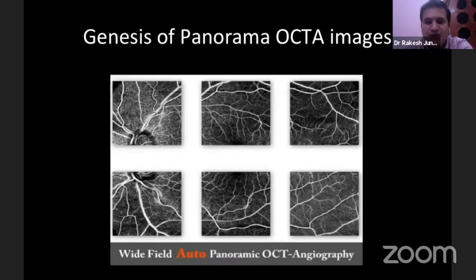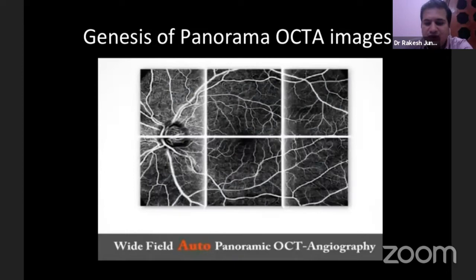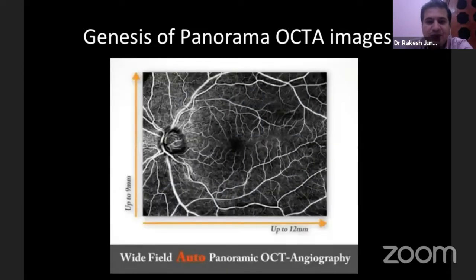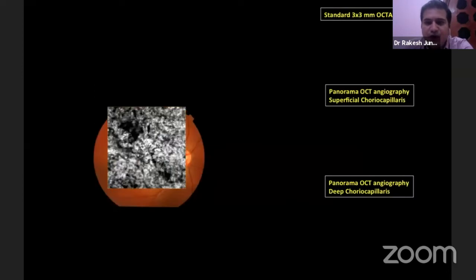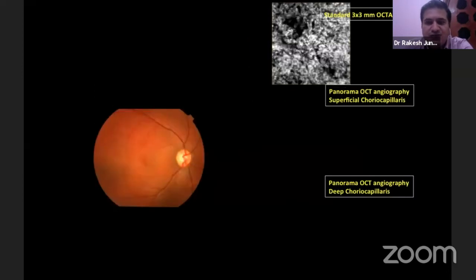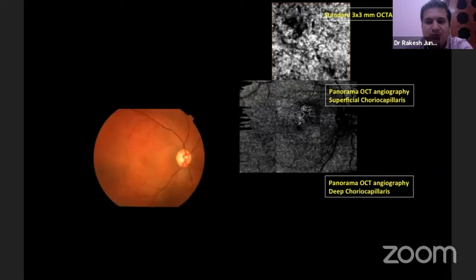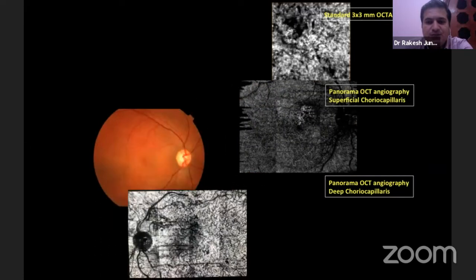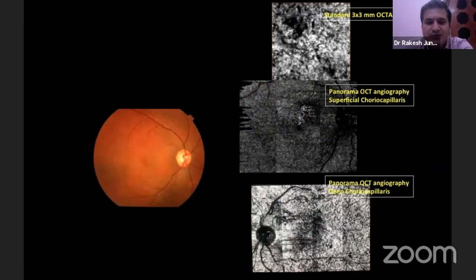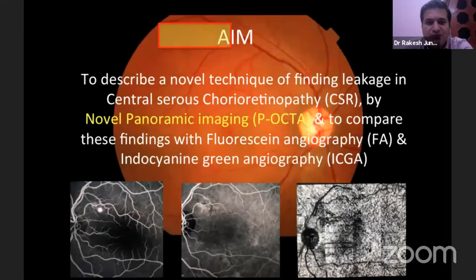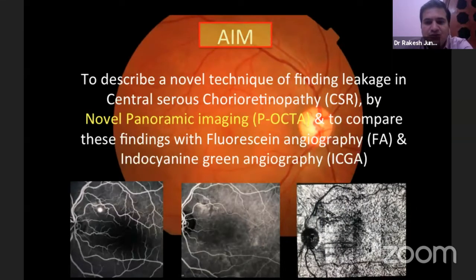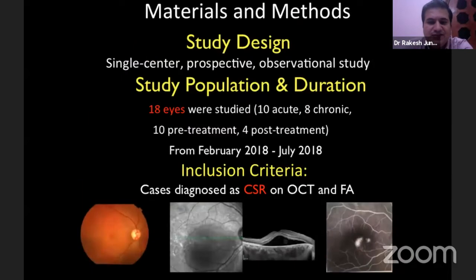This is how we generate the panoramic OCT angiography images. We identify a bigger cube — a standard cube giving you one picture — and then a comparatively large panoramic cube at different layers. We then tried to correlate our panoramic OCT angiography with the age-old invasive tools, fluorescein angiography and ICG angiography.